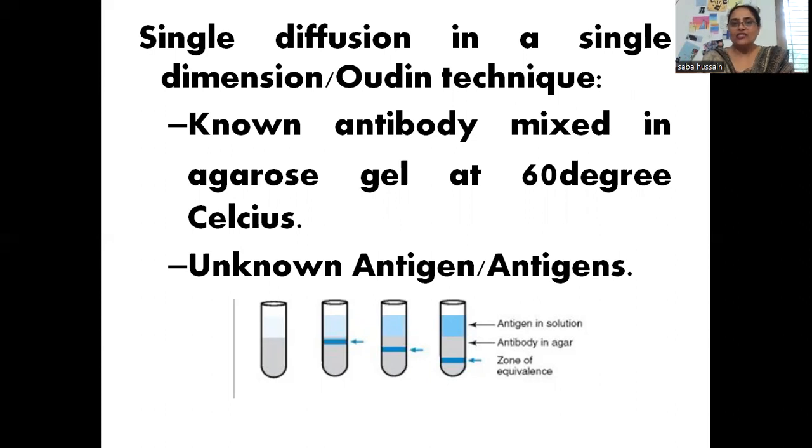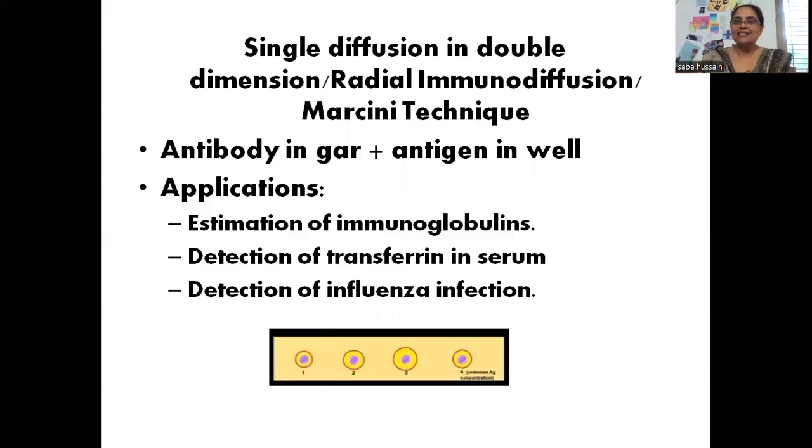You can see this diagram is important, and here you can see the different tubes. If this is a negative test, there will be no precipitate, while in a positive test you can see the precipitation, and a test will be positive only when the corresponding antigen and antibody react. Epitope and paratope are going to bind. So to detect an antigen, this is a very important test.